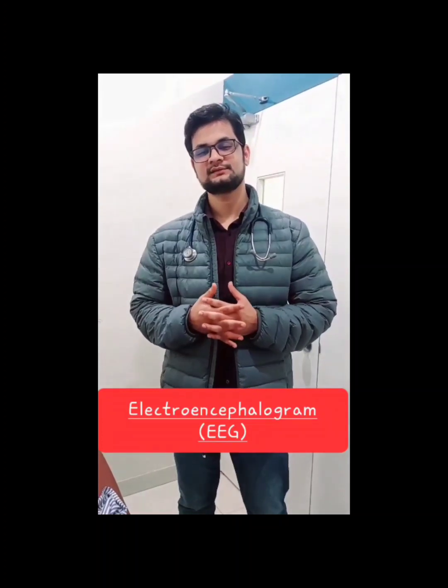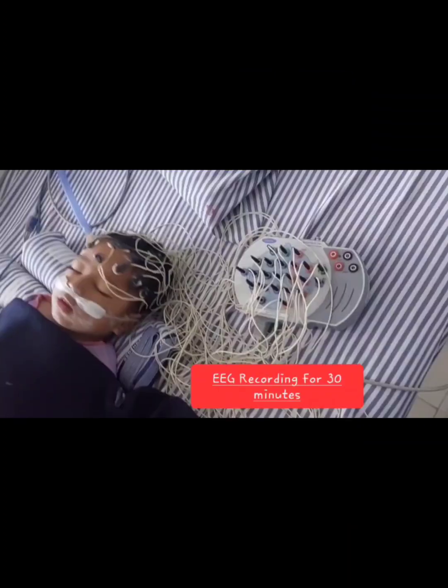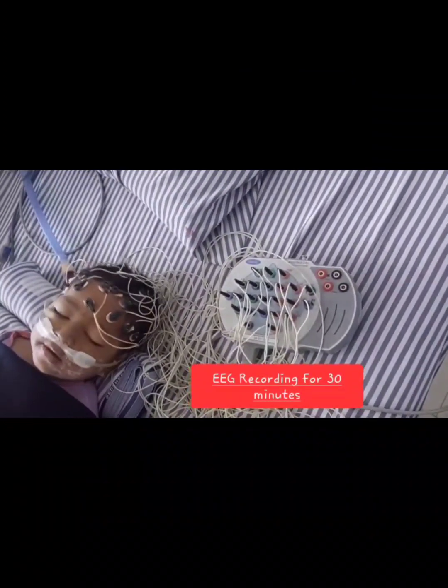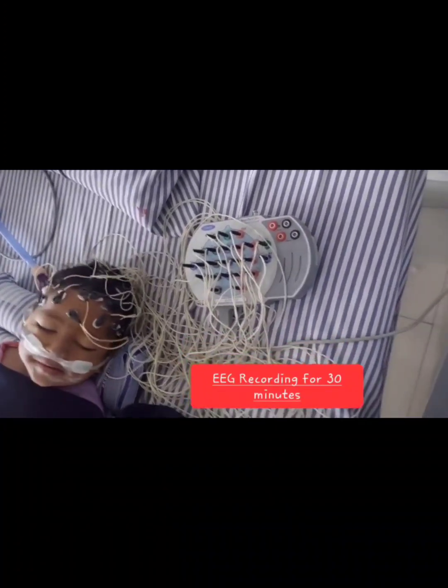Hello friends, in this video we are going to see about the EEG, that is the electroencephalogram. So let us see how the leads of EEG are connected and how it works. So these are the EEG electrodes. We have connected these EEG electrodes to the patient, and this is connected to the PC.